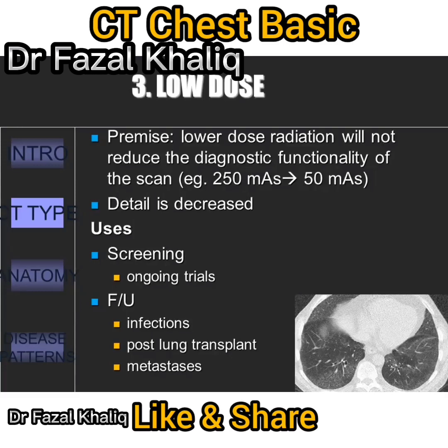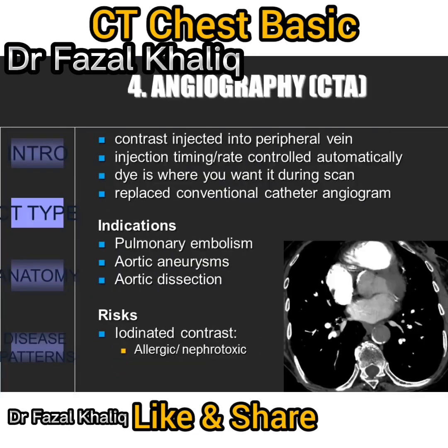Low and ultra-low-dose chest CT are already being used in some institutions, primarily for lung cancer screening. This is not, however, routine. Studies are underway to assess the role of low-dose CT scans in early detection of lung cancer in patients with emphysema.